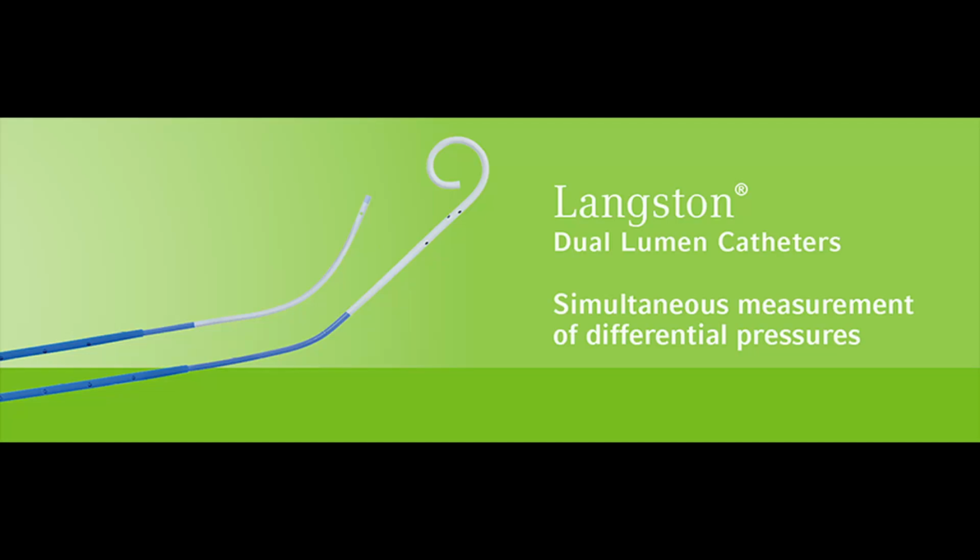In this video, we're going to discuss the Langston dual lumen catheter. This catheter allows for simultaneous measurement of differential pressures, usually in separate chambers.